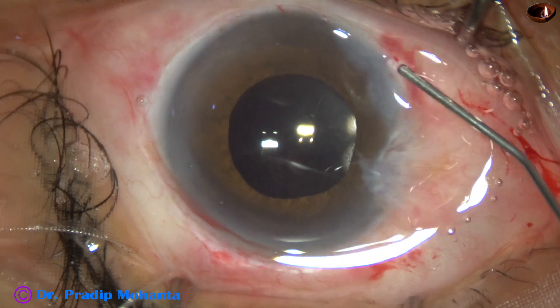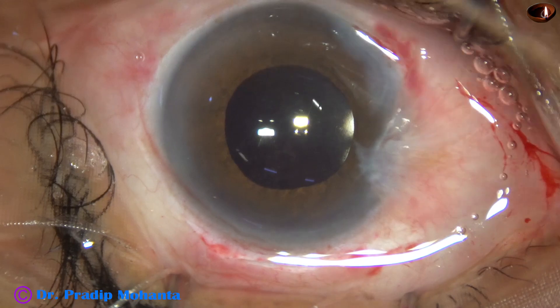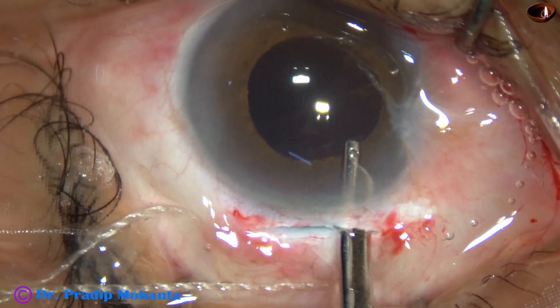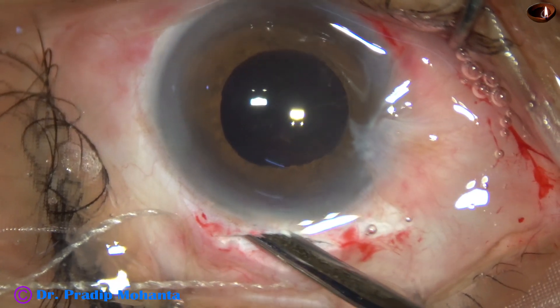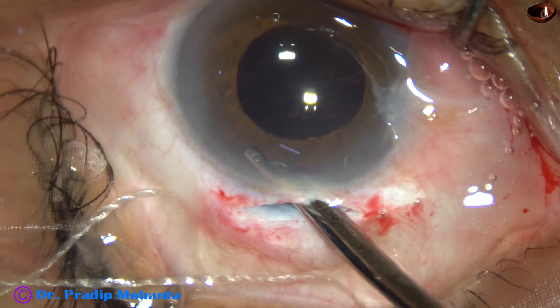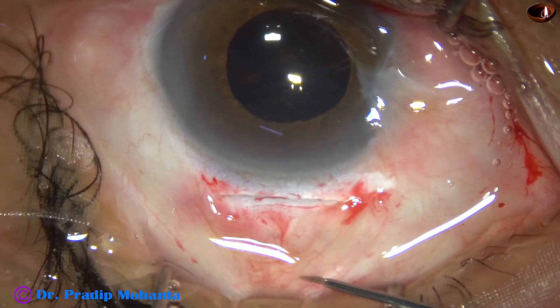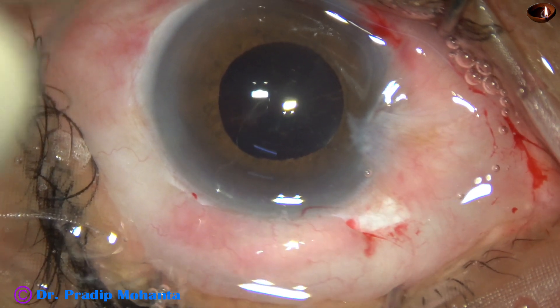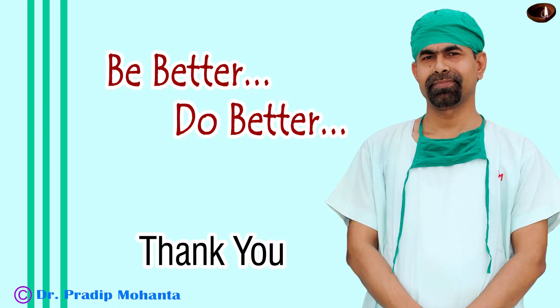I close the side port at 7 o'clock. The 2 o'clock side port has been used only once, so it doesn't require any hydration. This is the final lavage. The anterior chamber is formed in this way, and then this is a dexamethasone and gentamicin injection. The conjunctiva gets advanced to the limbus and the case is concluded. Thank you very much for your attention.